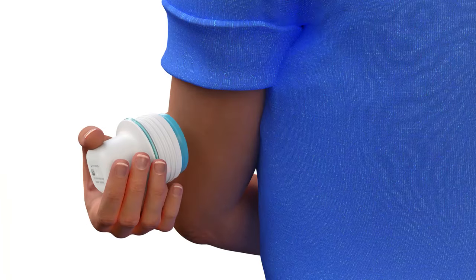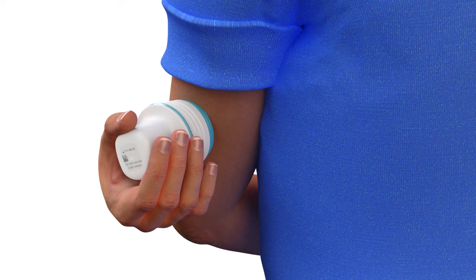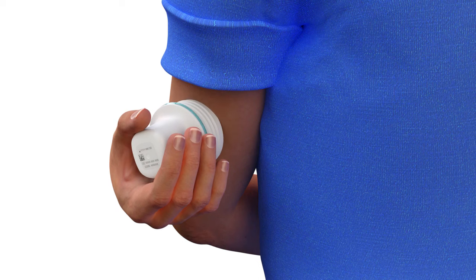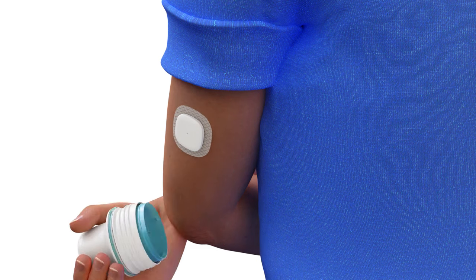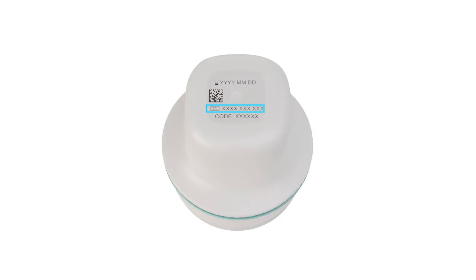Place the inserter flat against the site that you prepared. To insert the sensor, press firmly against the body until you hear a click. Gently pull the inserter straight away from the body. Keep the serial number (SN) and the code to use later to pair the Simplera sensor with your compatible display device. The SN and code label are also on the inside of the Simplera sensor box lid.